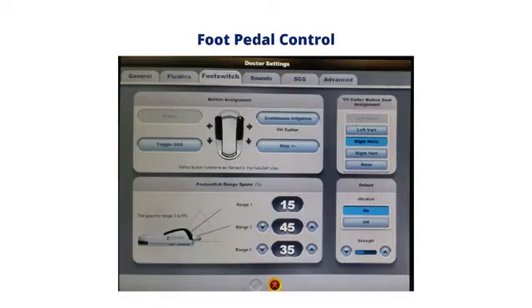So you can adjust this so that you can move through the different modes as you actually go from step 1 to step 2 to step 3, and you can control the amount of pressure you have to apply to the foot pedal to move on to the next stage of the surgery. And of course, for myself as well, in the foot pedal, you can actually move from your sculpting to your segment removal I/A, all controlled with the foot pedal, and that's what I tend to do.